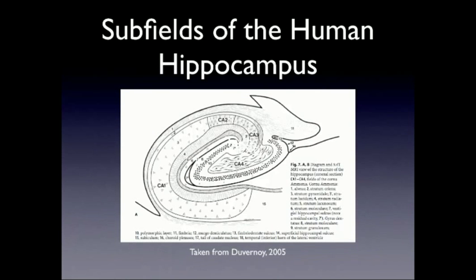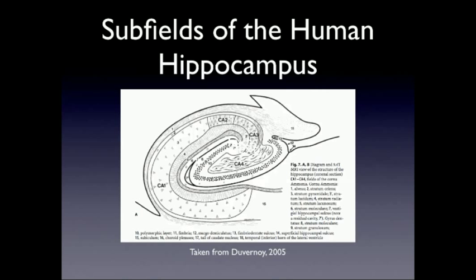And even more detailed, the hippocampus is made up of distinct subfields which have different functions. I'm not going to get into the point of these functions, but the idea here is that there's these very detailed regions that you almost have to do manually. And we're going to be focusing on the dentate gyrus, which is this oval in the middle, the cornu ammonis, the CA structure, is this strip of tissue that wraps around it, and there's this band of white matter that separates the two. So for these exercises, that's all you need to know.